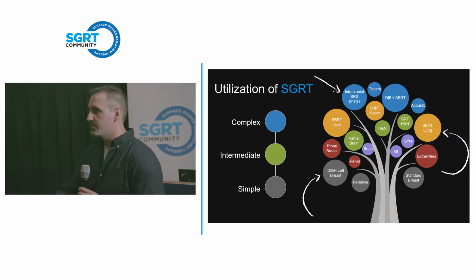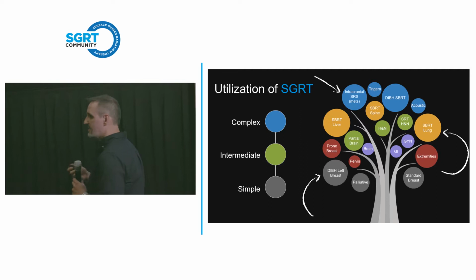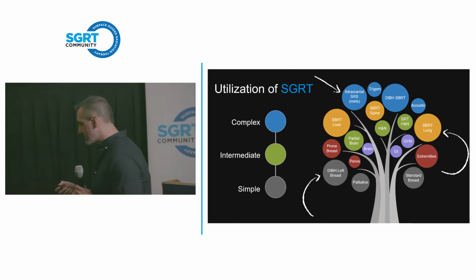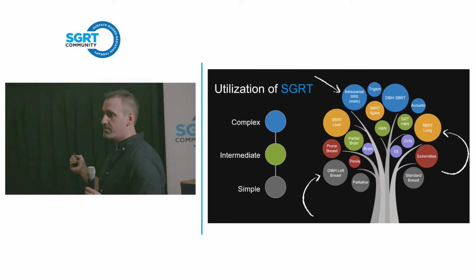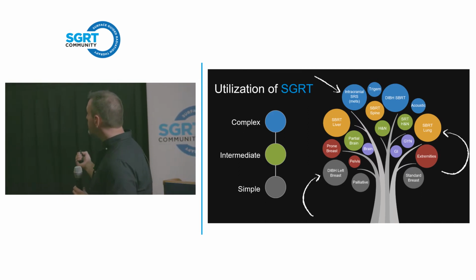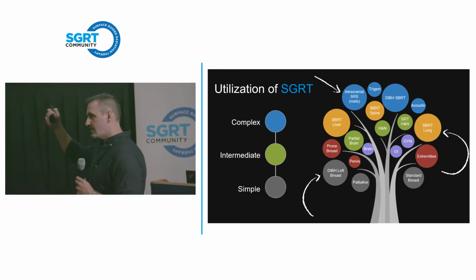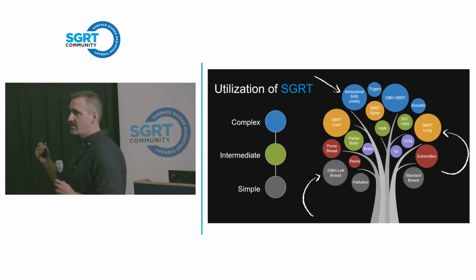They deserve SRS tolerances. Every single patient, after the physicist commissions these systems, gets the SRS tolerances that you commission the system for. So it's basically a system that starts at the top, and everyone propagates that accuracy back down the tree. And so no matter what you're implementing this for, you actually get the benefit of the most technical, most accurate implementation as you move back down that tree to other things.